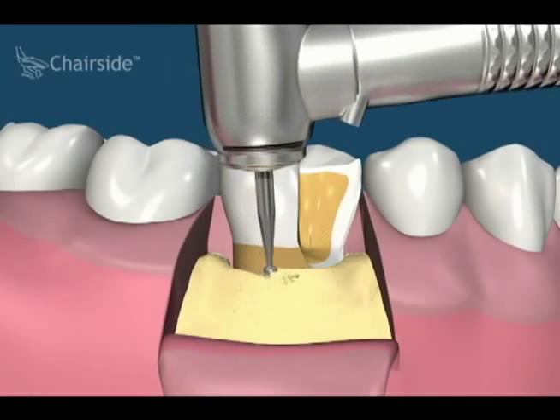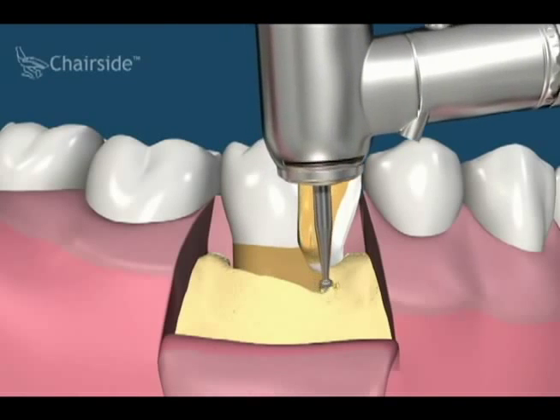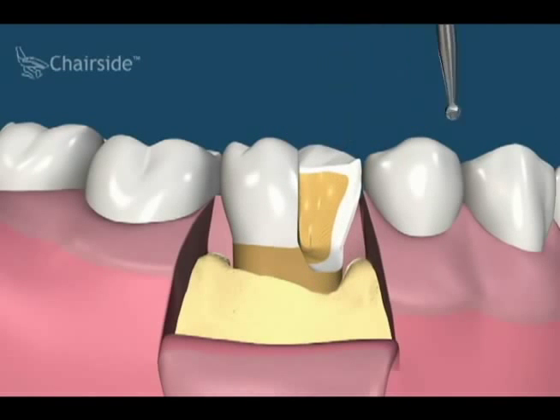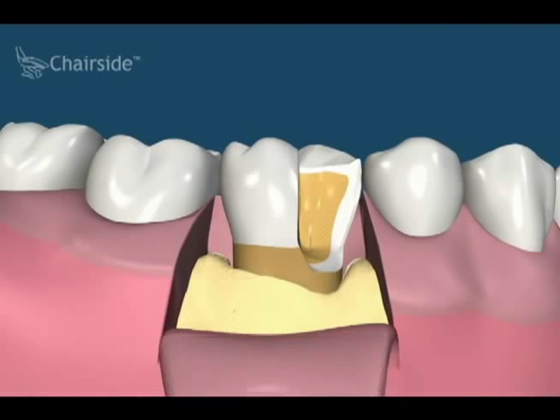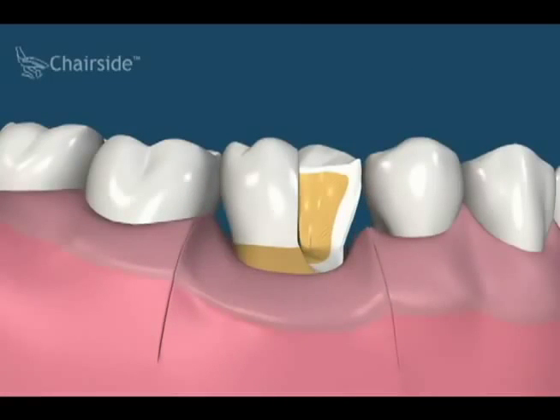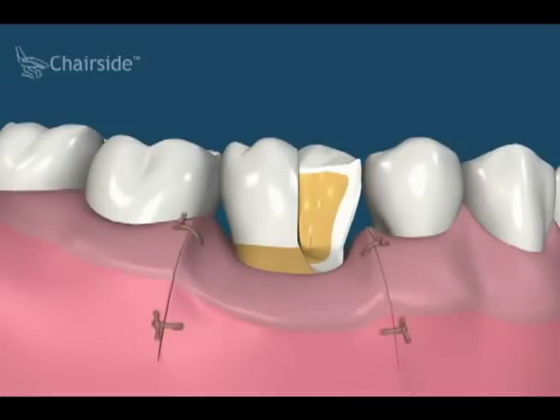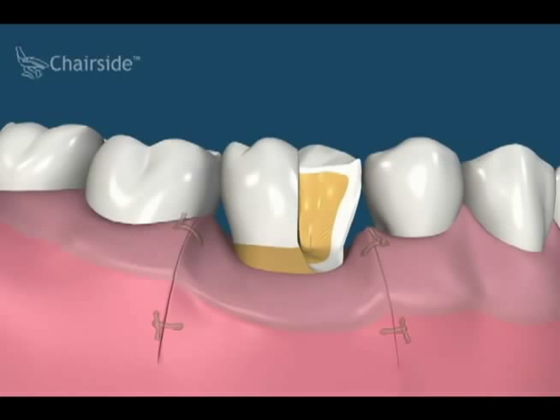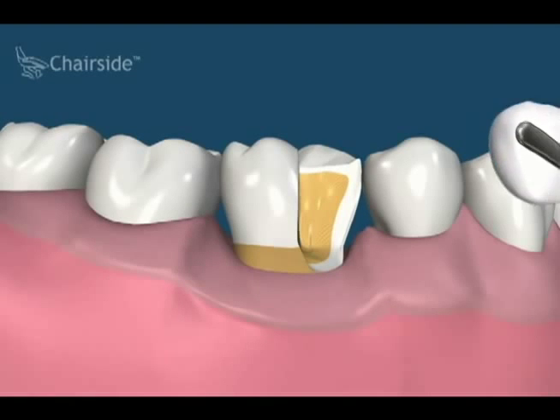Different instruments, including the dentist's drill, are used to reduce the bone height, and this new bone architecture is prepared to support the gums in a lower position on the root of the tooth. The flap is repositioned and sutured into place. After healing, the tooth can now be restored.